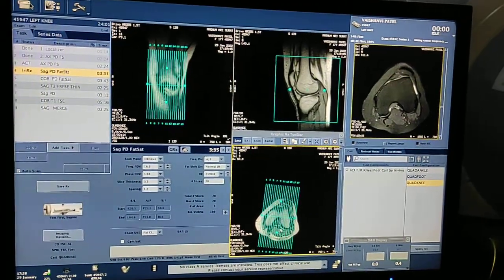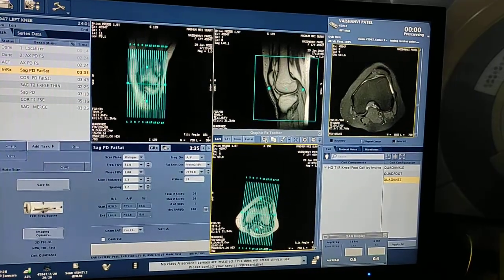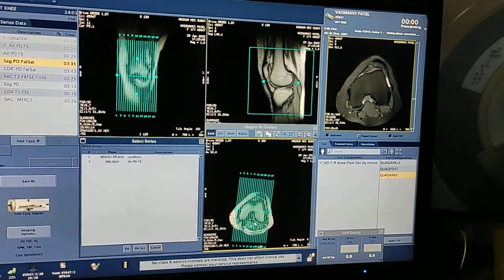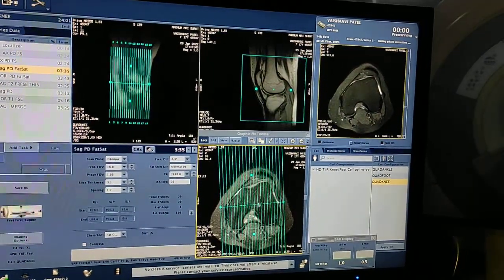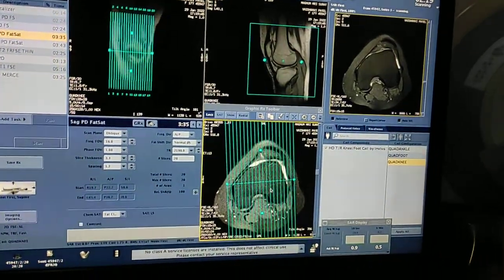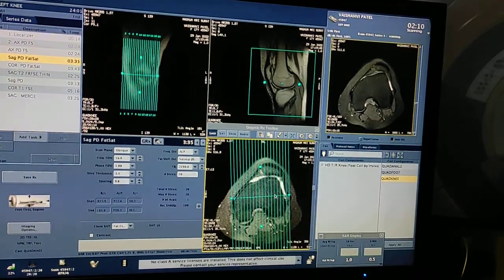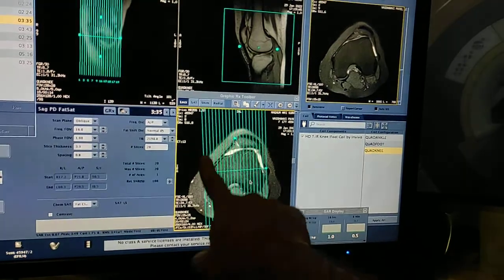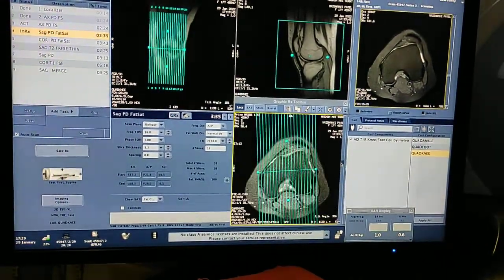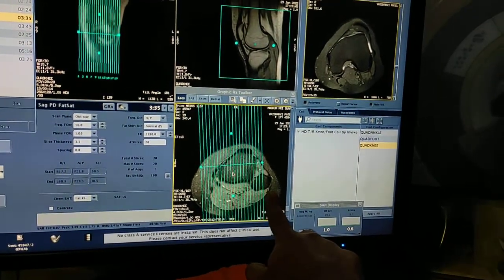Double click on the axial FS PD image, click on the axial window, then click on the toolbox and select the axial PD. The axial PD fat sat is now in the axial window. Now according to this we plan the rest of the sequences. I will reduce spacing to 0.8. You have to see the condyles and plan perpendicular to both the lateral and medial condyles. I am taking from right to left — medial to lateral.